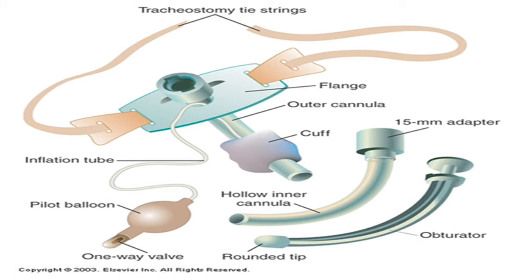the day. Depending on where you work, as a nurse, you may be trained to do that. But oftentimes it's respiratory therapists who will check that cuff pressure. And you will see there's a pilot balloon with a little tube that leads down to the cuff. The pilot balloon is where you insert a syringe and actually inflate that cuff. It has a one-way valve there. And let's go further and look at the other parts of the tracheostomy tube.